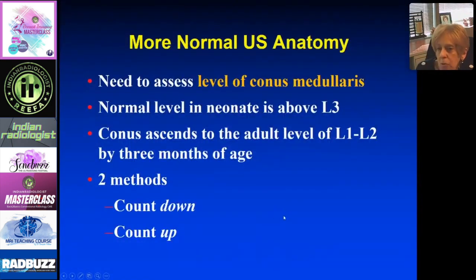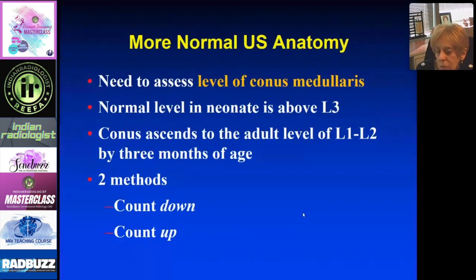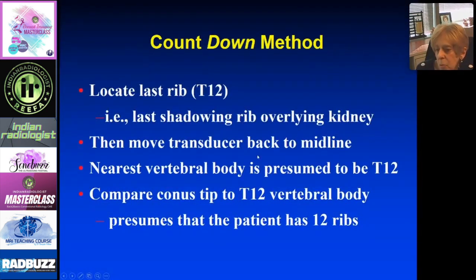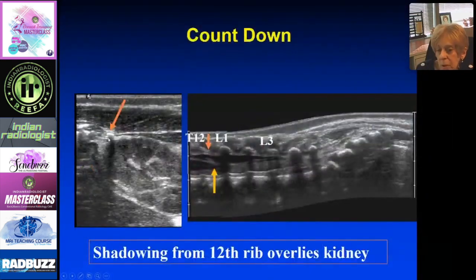You need to determine where the level of the conus is, because normally it should be above L3 and ascends to the adult level of L1-L2 by three months of age. There are two ways to do it: count down or count up. To count down, you find the last rib — the last shadowing structure overlying the kidney — move the transducer to the midline, presume that is T12 if the patient has 12 ribs, and count down. So here is the last rib casting a shadow over the kidney, and from there we count down to determine that the conus is at L1.